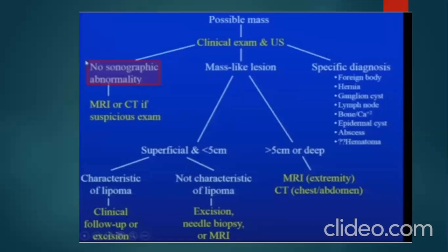So one thing that you need to know is the limitation of ultrasound as a modality. It is not a superhero. It's not going to do justice in all the lesions that you're going to encounter or in all the clinical presentations of patients. So you need to know where your ultrasound is limited and recommend other imaging modalities that are superior to ultrasound, for example, MRI or CT scan, so that we do justice to the lesion that we're dealing with, or to the patient rather.